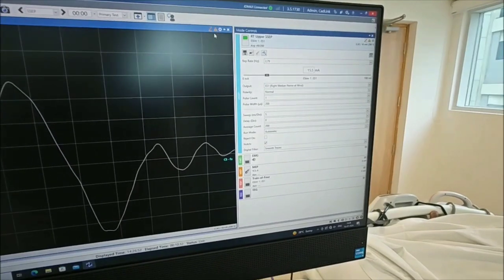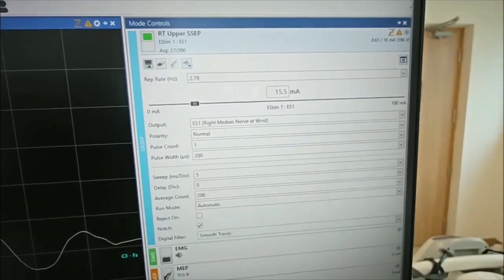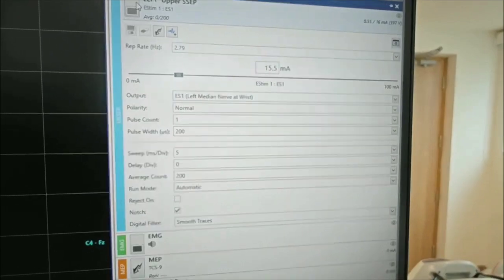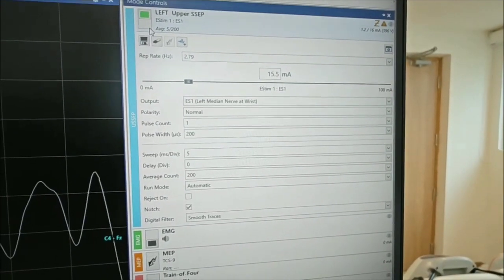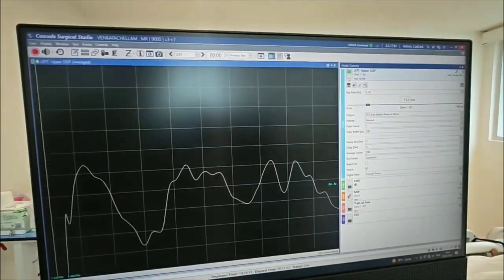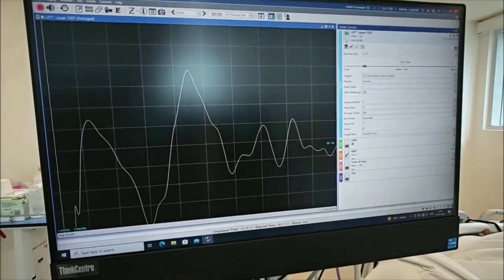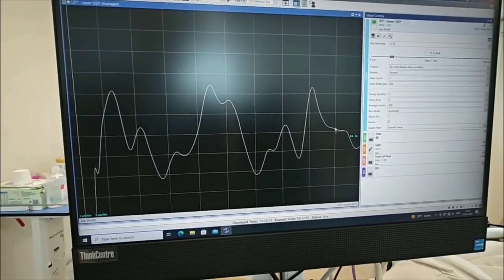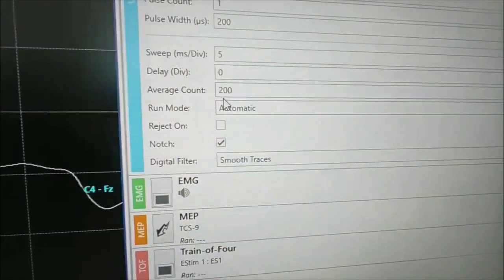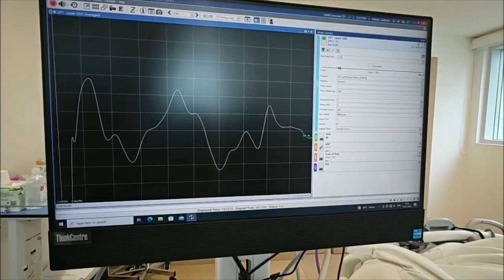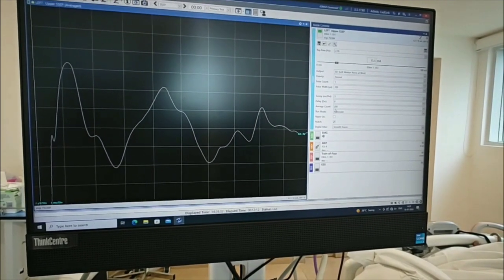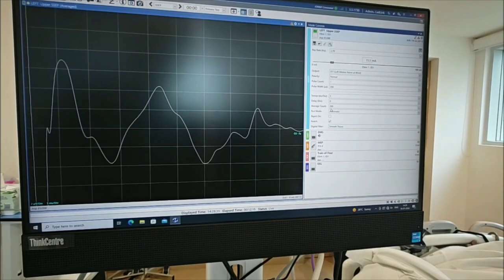The current I'm using is around 15 milliamps, and it can go up to 20 milliamps for the upper limb. For the lower limb, we should use less than 30 milliamps. The average count is 200. Averaging is done to remove noise from the signal — as it averages, the noise keeps cancelling out until you get a clear waveform.